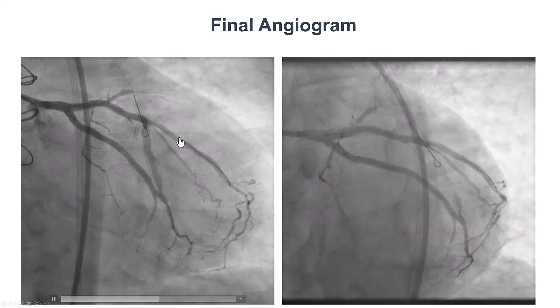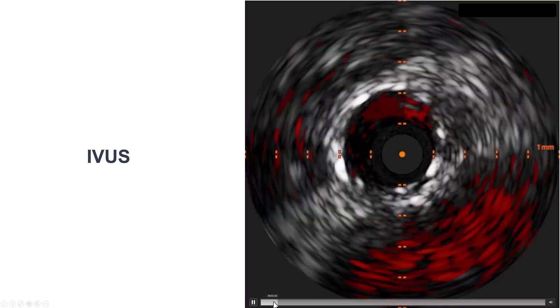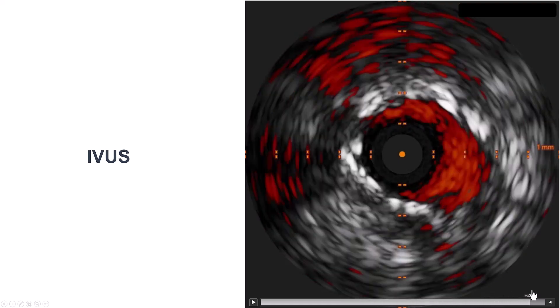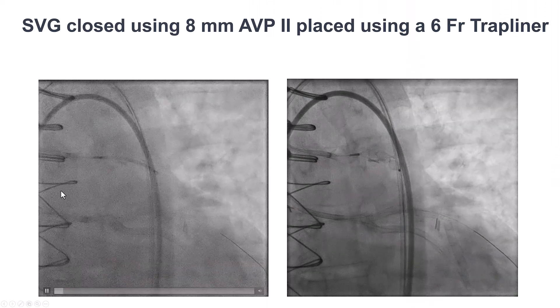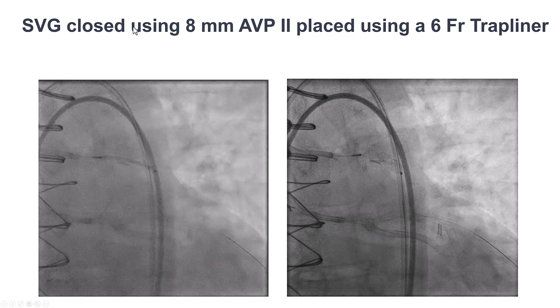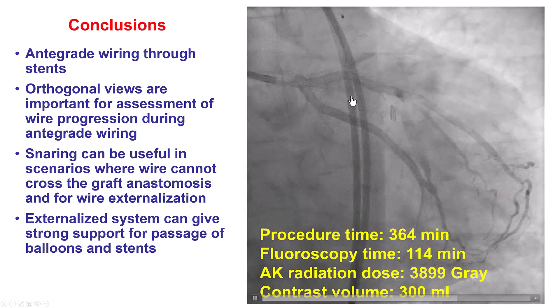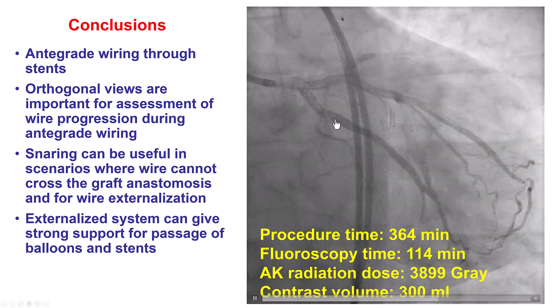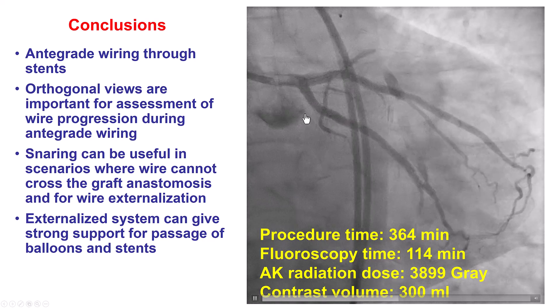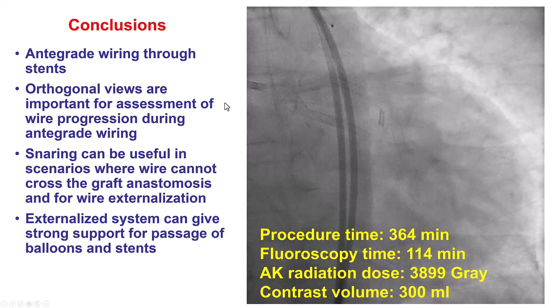There was still significant competitive flow through the graft, which we know can be a problem. We performed intravascular ultrasound that demonstrated good stent expansion and stent apposition all the way to the ostium. Because of the competitive flow, we decided to occlude the saphenous vein graft using an 8 mm AVP2 plug, which reduced the antegrade flow, and now we have flow going through the RAMUS and OM through the left main. The patient had a nice recovery — it was a long case with significant fluoroscopy time and contrast volume, but also provided multiple lessons.